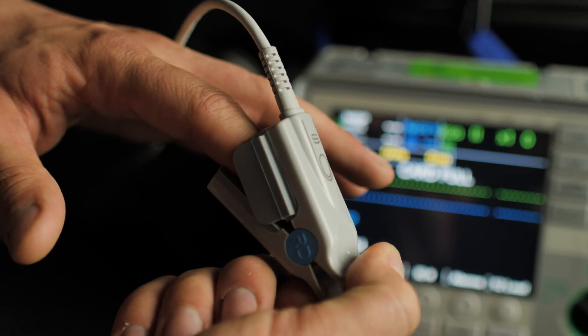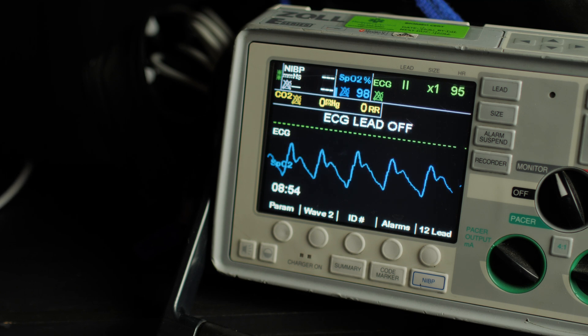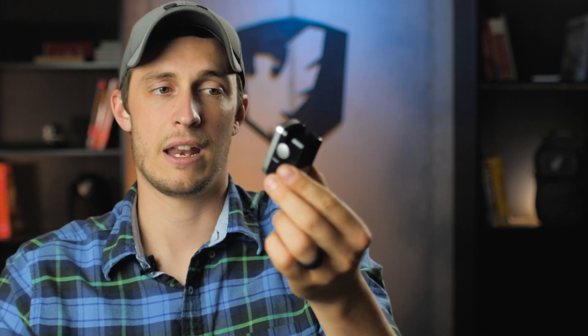The normal range for oxygen should be between 93 and 99%. There are a couple of different types of pulse oximeters. There's a little portable one you can get off Amazon for about $20, and then there are more advanced ones that give you a waveform showing how accurately it's reading — those are typically on cardiac monitors used by EMTs and paramedics, but standalone waveform devices are also available.